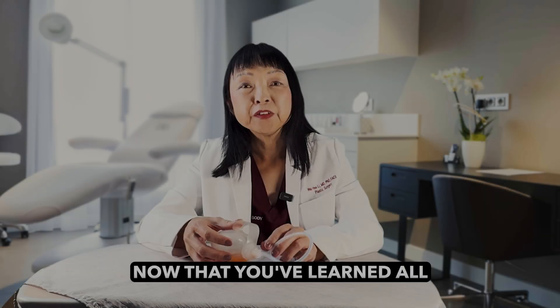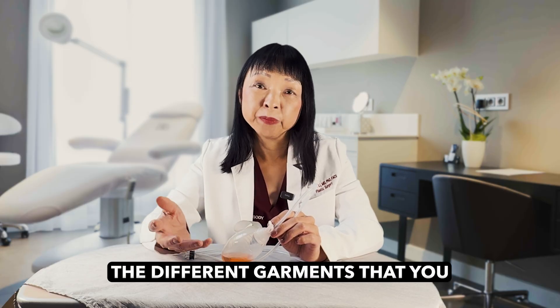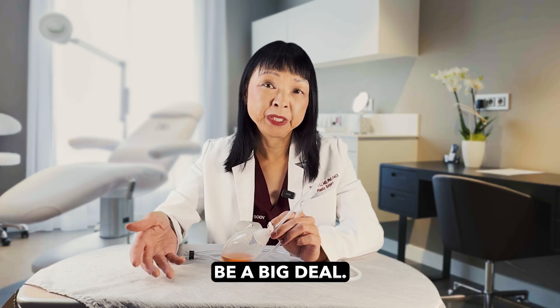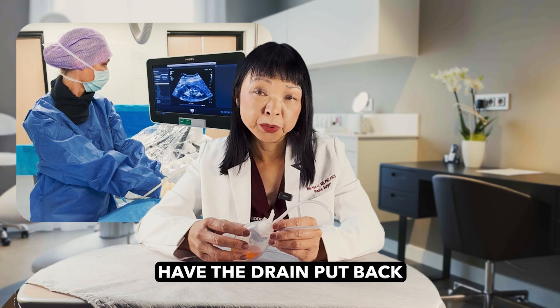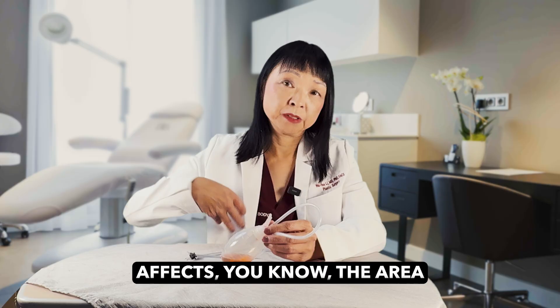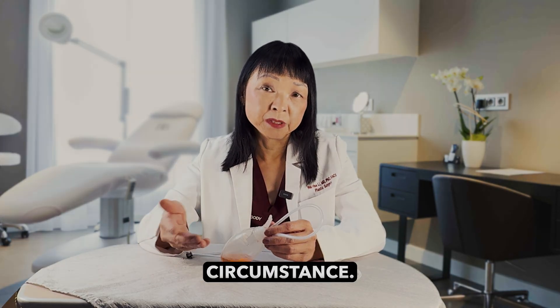Now that you've learned all about surgical drain care, there's one more video you should watch that tells you about different garments you can use to protect your drain. Remember, if you pull out your drain prematurely, that can be a big deal — it might mean a trip to the radiology department to have the drain put back in, or in some cases you might have to go back to surgery, because removing the drain prematurely can affect the skin and in rare circumstances can cause internal bleeding.